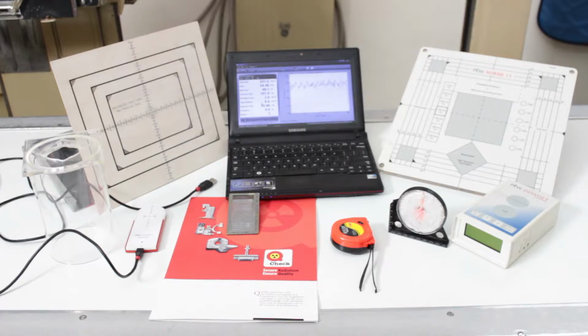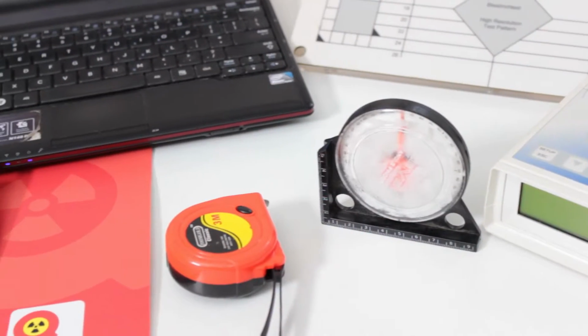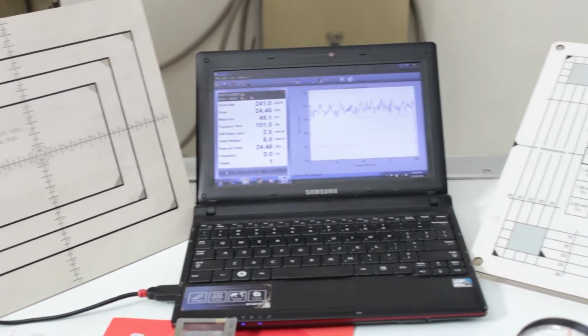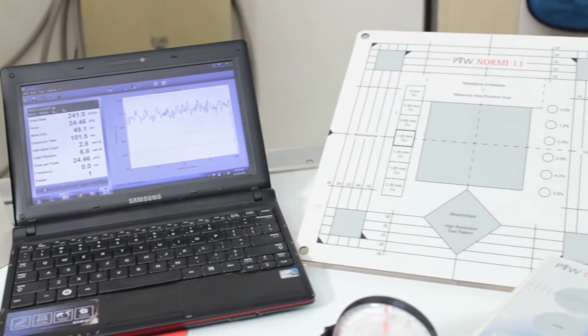Retakes result in unnecessary radiation both to the patient as well as the staff. Retakes overload the machine, which will also reduce the life of the tube. QCheck methodology is based on the standards set by AERB. The test methodology includes conducting tests as per the prescribed procedure, recording and analyzing the results, and seeking corrective actions.